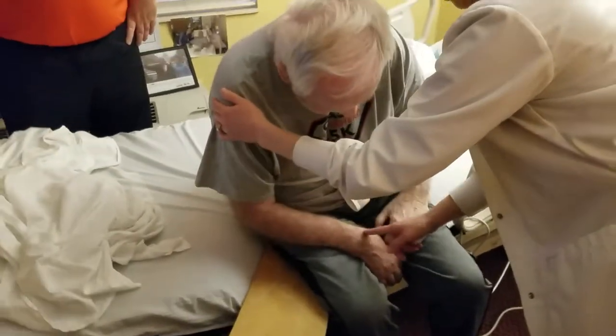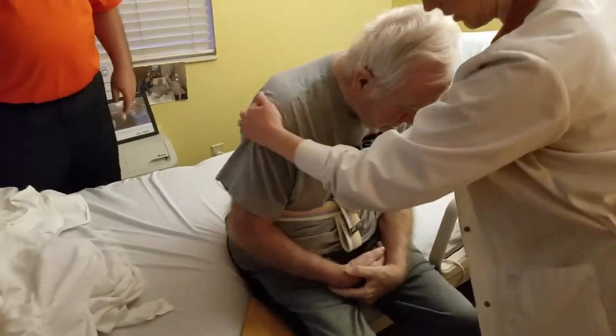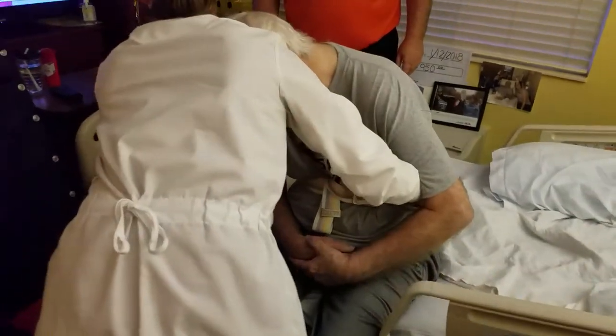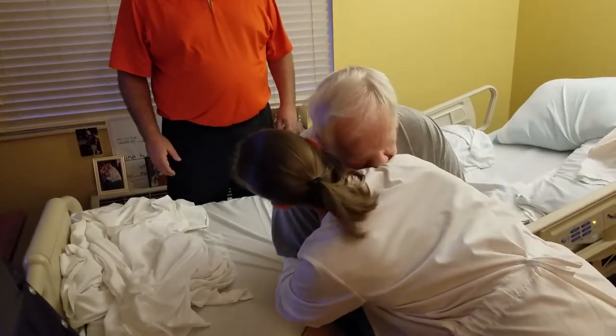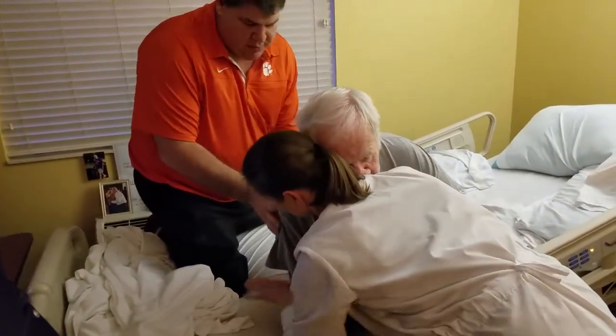Mr. Dreyer, I really need you to hold on and grab with that hand. The shoulder should be up top — good. I put one foot in between and the other foot closest to the chair, so I'm on the weak side with both legs kind of in between. Then I grab hold of him — since I'm closest to the chair I know where we're going — and I kind of give him a hug, grabbing hold of the belt, and we rock forward like this.